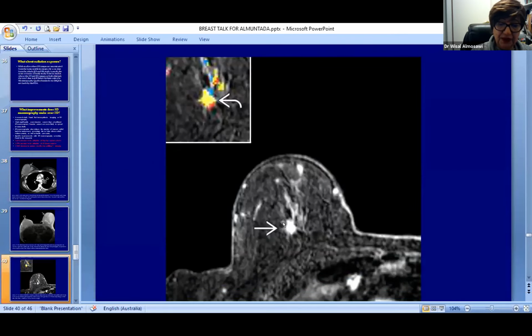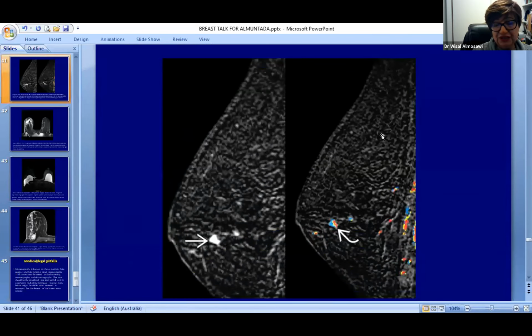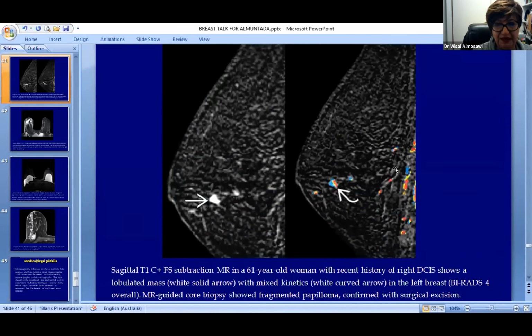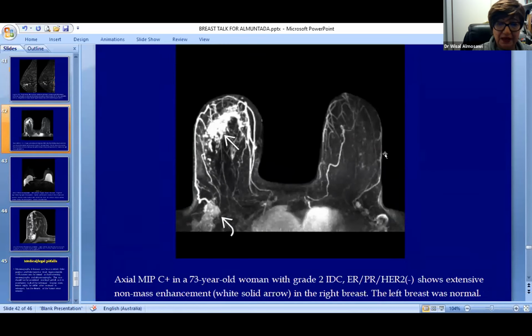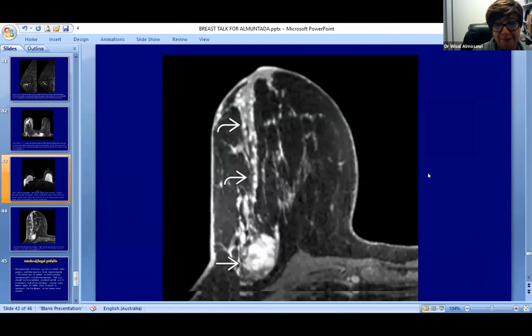And this is what it looked like. And when they enhance and they light up like this, we know definitely it can detect lesions smaller than 5 millimeters. So it's superior to the 3D mammography and ultrasound. It will show you even ducts into the nipple. MRI is very good also for breast implants, because it will show you the internal, external capsule and collapse.